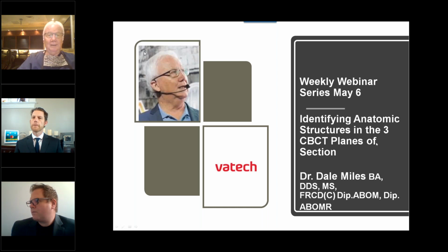Movement, I see it all the time, and sometimes you just have to bite the bullet and tell the patient we've got to rescan you because there's too much movement. Dr. McClammy's assistant had one this week. He was an 87-year-old man who they had to do a scan where there's one pass, then a little change of position, and then a second pass, and they stitch it together. Well, he talked through the entire image capture. They ended up taking 3 scans, and between the 3 sets of data, I could actually get all the findings, but some of the images were terrible. So minimize or eliminate movement if at all possible.